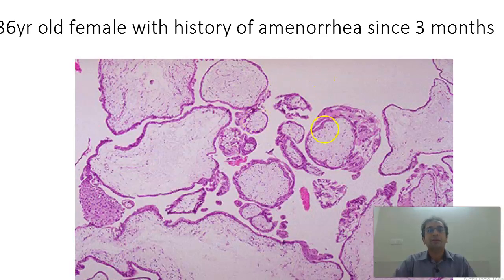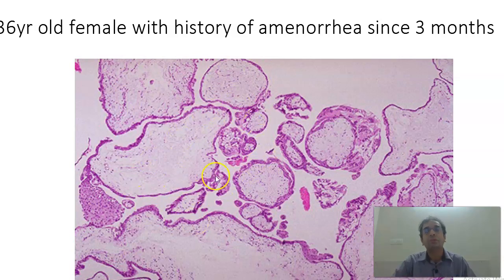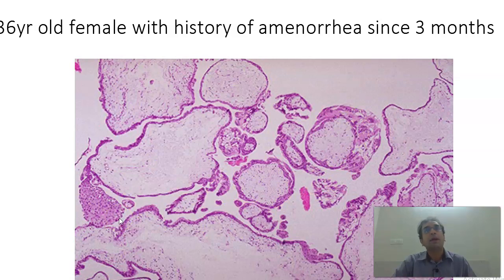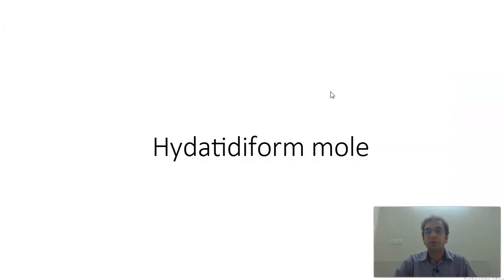A very common slide in the MBBS exam is a 36-year-old female with history of amenorrhea of 3 months. Usually this patient will have passage of grape-like vesicles. What you find here are voluminous, huge chorionic villi with hydropic change, with cytotrophoblastic and syncytiotrophoblastic proliferation which is circumferential all over. We do not find nucleated RBCs — it is more or less circumferential trophoblastic elements. This is a hydatidiform mole of the complete type.